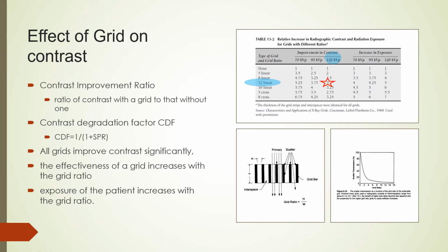Based on what we have learned so far about grids, we can conclude the following. First, all grids improve contrast significantly. Second, the effectiveness of a grid increases with grid ratio. And third, patient exposure increases with grid ratio.